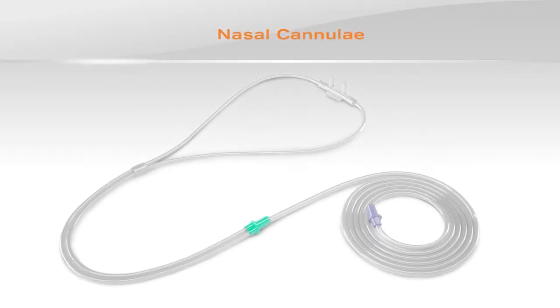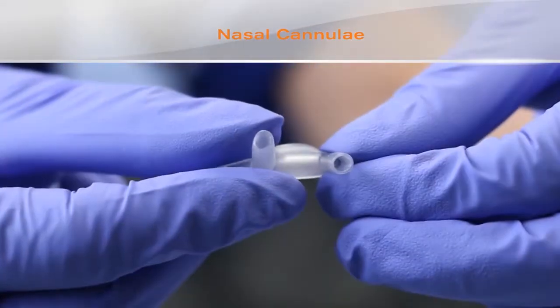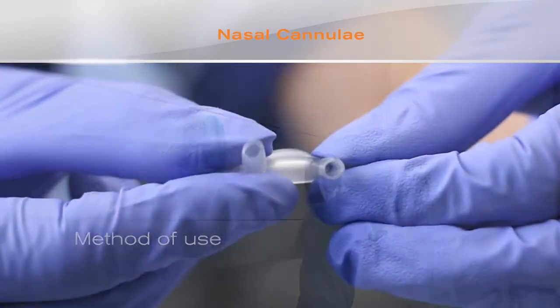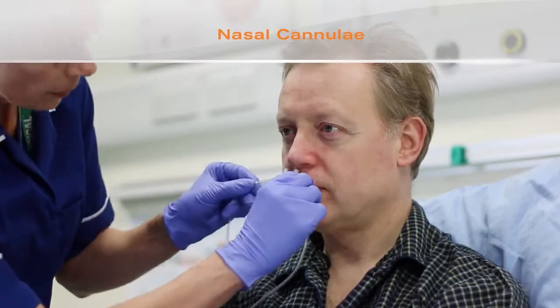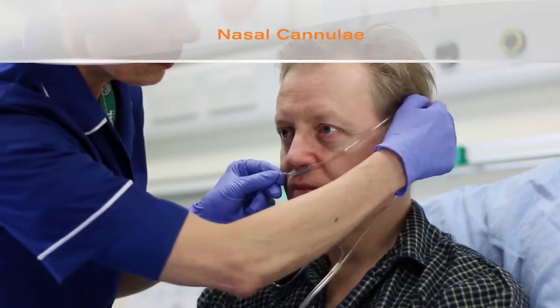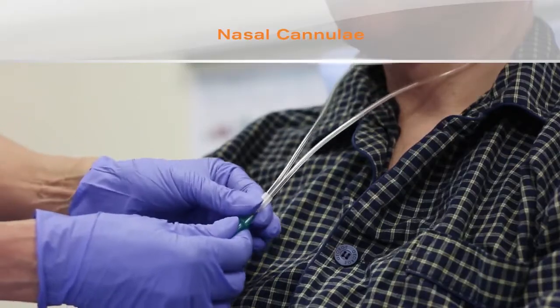Nasal cannulae are one of the most common ways of delivering oxygen therapy. A nasal cannula consists of two soft prongs attached to the oxygen supply tubing. First, attach the oxygen tubing to the oxygen flow meter and set the flow rate to the appropriate flow for the patient. The prongs are inserted into the patient's nares, the tubing is looped over the patient's ears, and the toggle is adjusted to ensure a good fit.